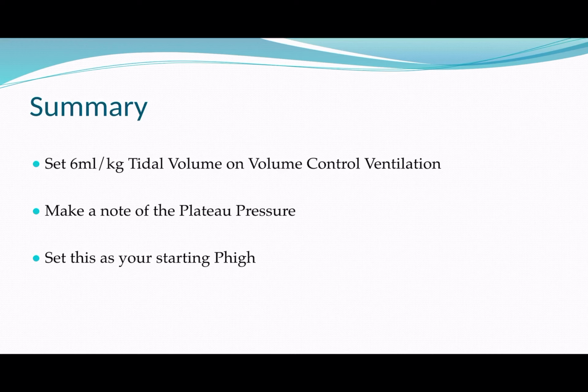So if the right side of the chest has a peak pressure of 30, and the left side of the chest, because it's plugged up with lots of sputum, has a -5 or 0 pressure on that side, of course all of the blood is going to suddenly start rushing over towards the side that's not got the high intrathoracic pressure. So sometimes when you see patients with collapsed lung, you put them onto APRV, they can desaturate very quickly because you've shunted all the blood into the lung that's collapsed.